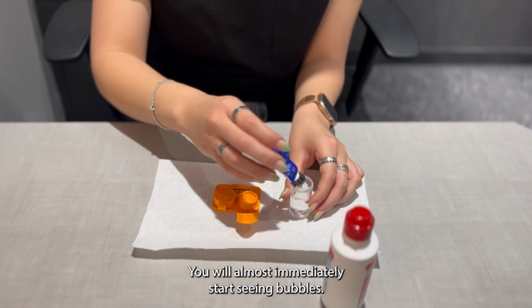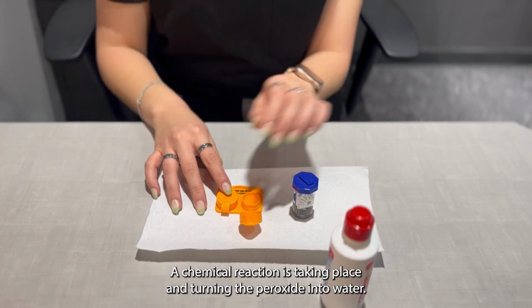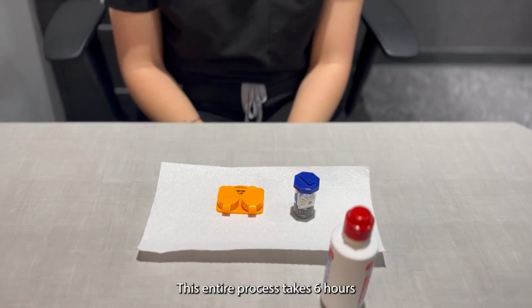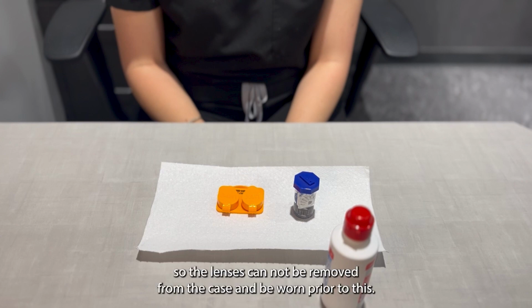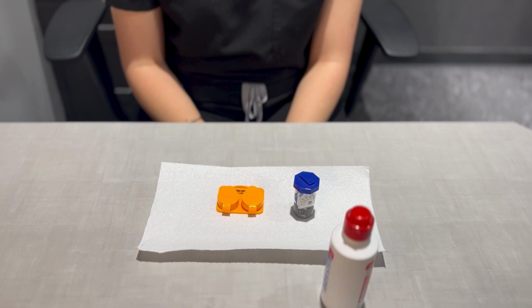You will almost immediately start seeing bubbles. A chemical reaction is taking place and turning the peroxide into water. This entire process takes 6 hours, so the lenses cannot be removed from the case and or worn prior to this. After the 6 hours, pour out the solution and allow the chamber to air dry. You may put the lenses into your eye. Rinsing with saline is optional, but not necessary.